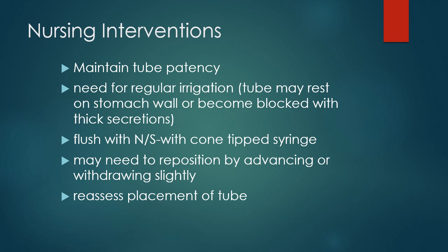And we may need to reassess the placement of the tube. If for some reason the tube is not draining properly, then we need to check to make sure that the tube is still in the stomach.